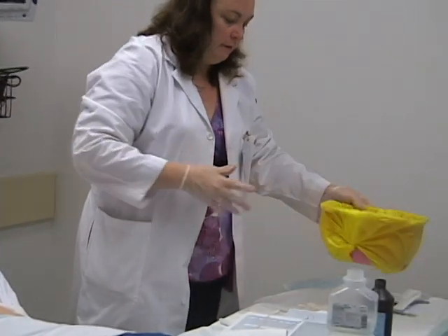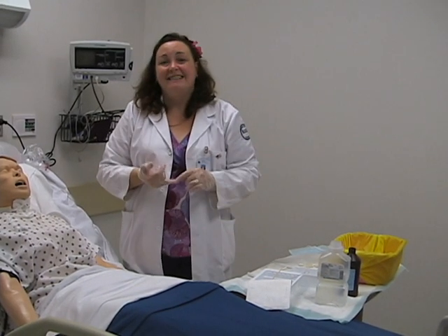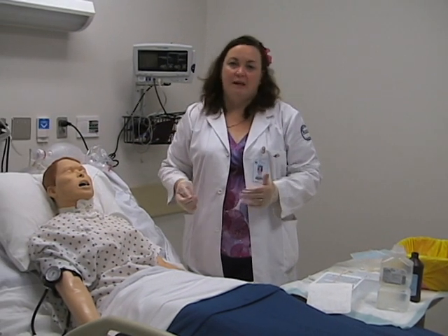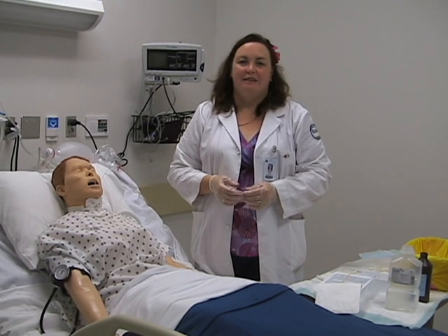And there we have the tracheostomy care done for a patient. When you're done with the care, remember to remove all the supplies that you've had. Go back to the desk and document the date, time, care that was done, the amount of secretions, and how the patient tolerated it. I appreciate you viewing this video and you have a good day.